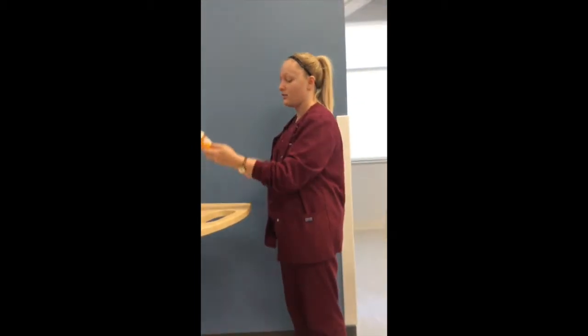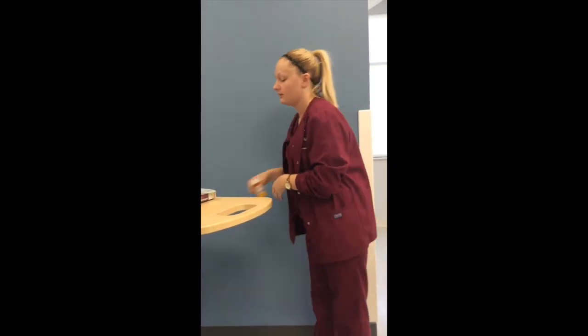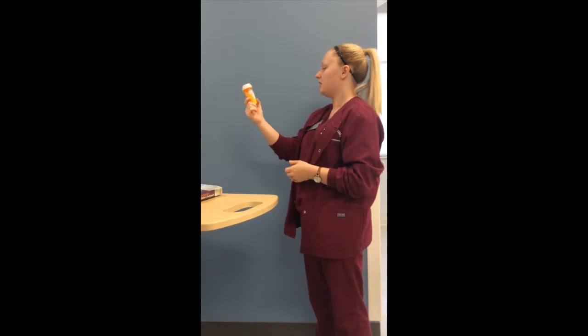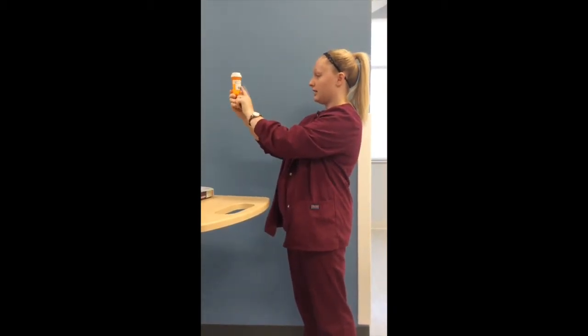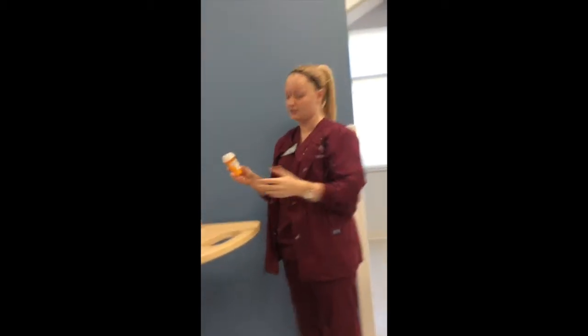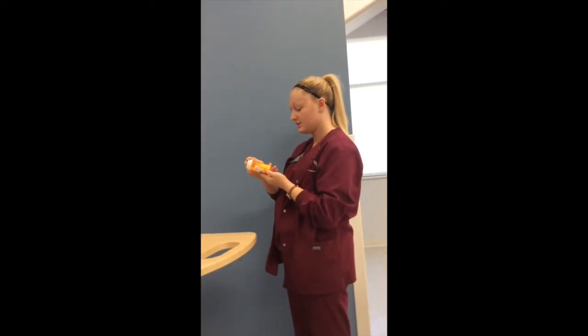So right now we have ordered Lasix 10 milligrams per milliliter. I see that on the MAR, so I'm going to pull it from my medication holder and get it out. I'm going to say, okay, yes, this is the right patient, the right medication, right dose, right time. I'm going to confirm all the 6 rights. I'm also going to check the expiration date on this medication, and it has not expired yet.